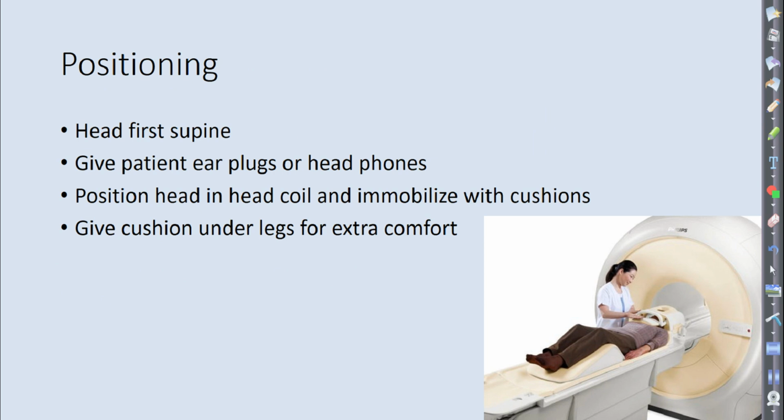So if you're worried about a pituitary tumor, where are you putting the laser light? What's associated with the pituitary gland? The chin. Mentum. Good. It goes basically directly close to you. What if you had a tumor in the IACs? Where are you going to be centering?